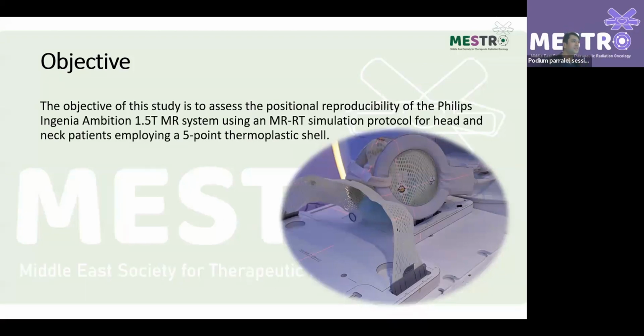Actually, he did his study without the patient. He just used the masks of the patients to get the signals. For the MRI, it needs hydrogen atoms, and hydrogen can come from the water. That's why, to enhance the image quality and to check these fiducial markers, he put a bottle of water on the downside of the thermoplastic mask for his study.